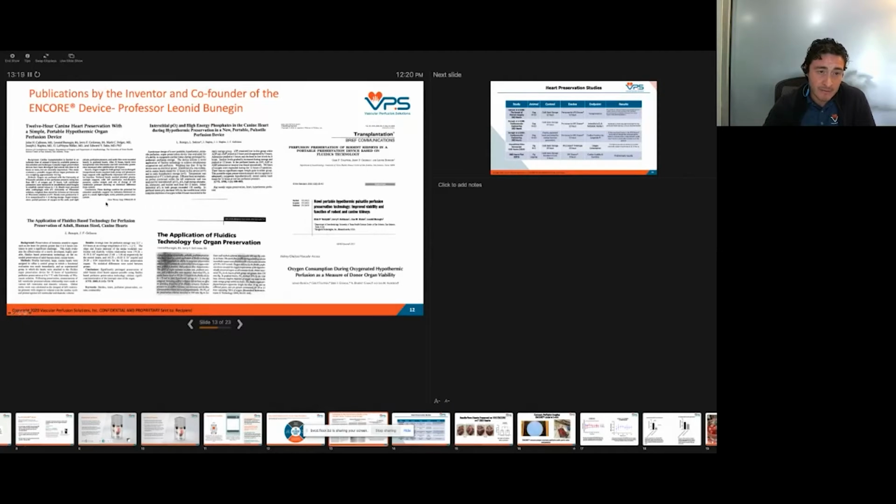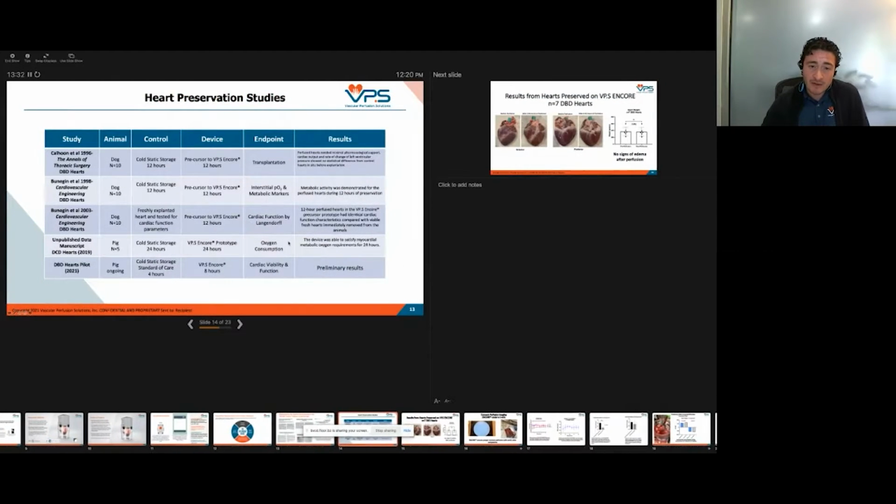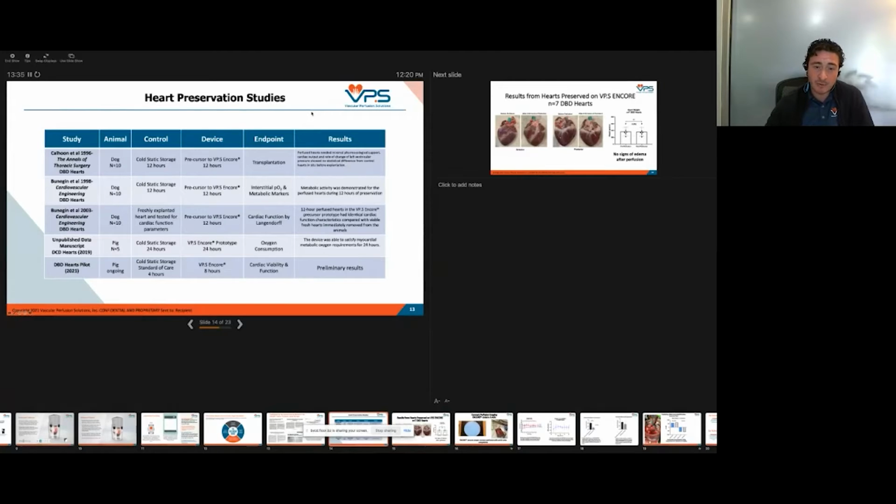He's done work on 12-hour preservation of hearts in dogs and in different areas, also kidney preservation. These are some of the key heart preservation studies that we used for our breakthrough device designation. The first study was done in 1996 with 10 dogs, and he compared that to cold static storage versus the device. They did an actual transplantation, and the hearts were able to perform normally for a few hours. They didn't follow for a longer period than that.